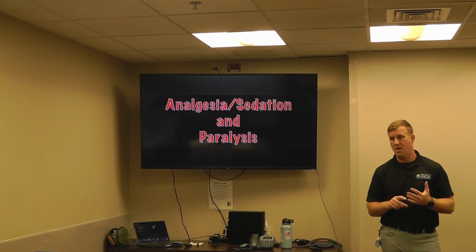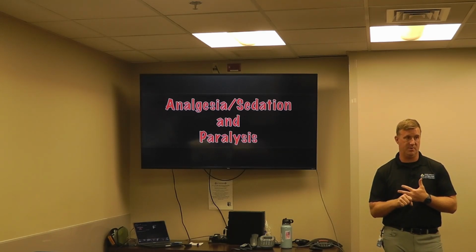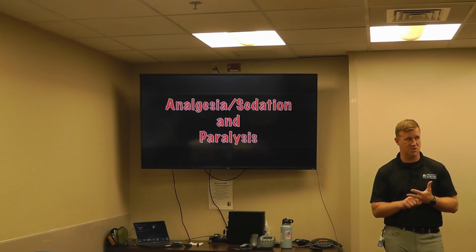I lost count. Awake paralysis may be the most brutal thing on the face of the planet, to have your body and diaphragm paralyzed and be fully aware of it. Seems like hell on earth to me. So if you're going to paralyze somebody, make sure your analgesia and sedation package is right first, and they're in a nice deep dark hole, and then by all means paralyze them if you need it.